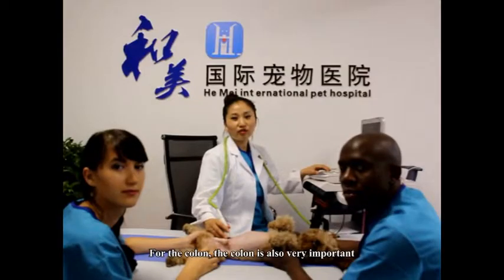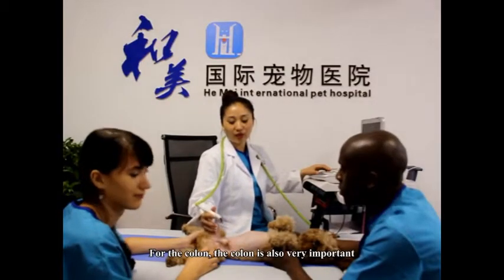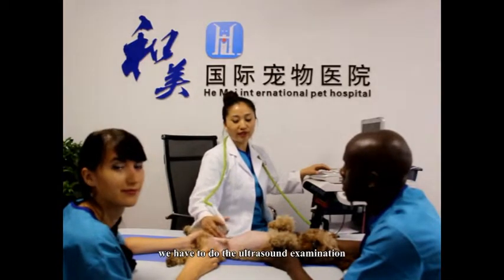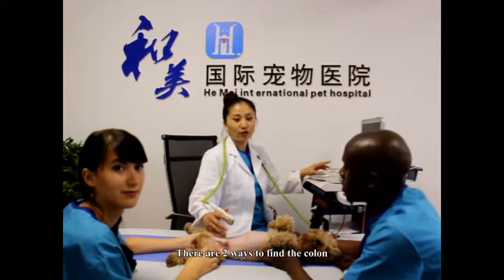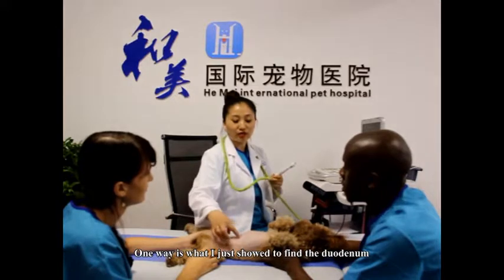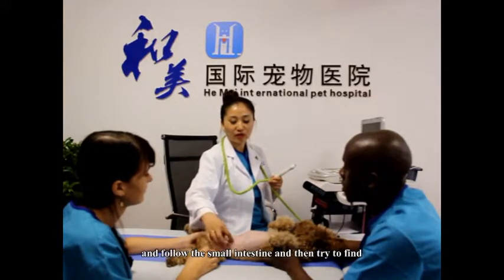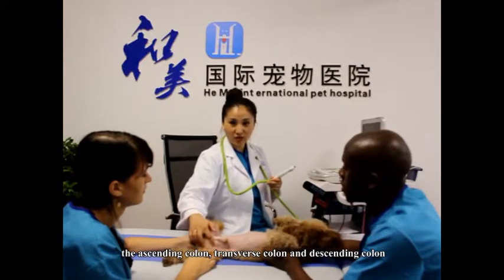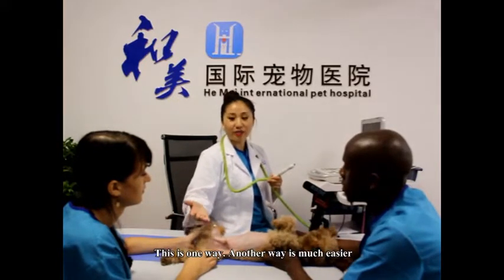The colon is also very important. We have to do ultrasound examination of it. There are two ways to find the colon. One way is what I just showed: find the duodenum and follow the small intestine, and then try to find the ascending colon, transverse colon, and descending colon. The other way is much easier.